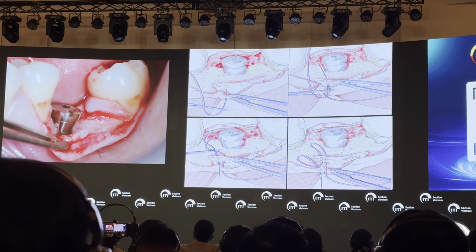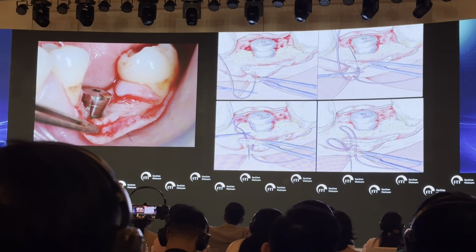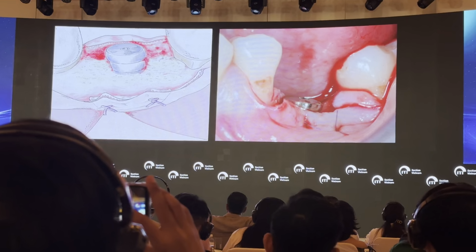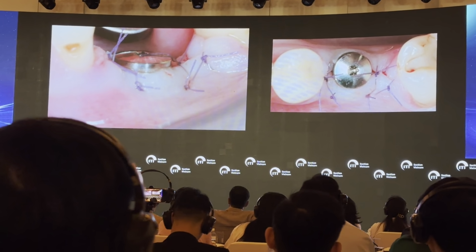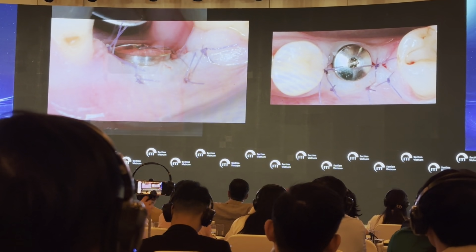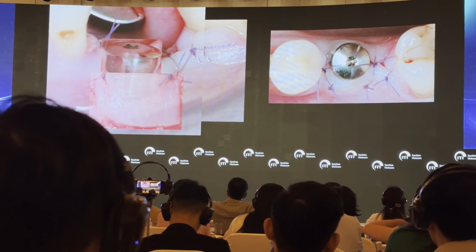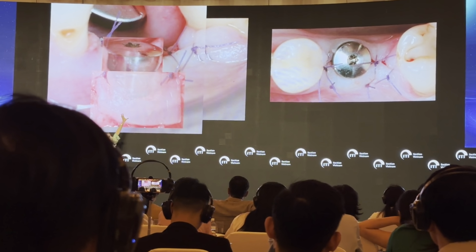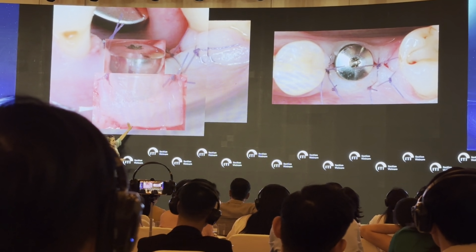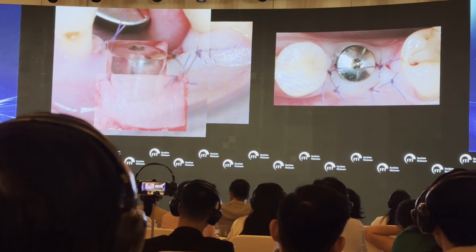The surgical papillae are free, the connective tissue graft is paramarginal, so at the time of suturing, I will put the surgical papillae in contact with the lingual flap, and the connective tissue graft is going to be at this level, covering the tissue level component of the implant and completely covering the buccal bone dehiscences, and the apical part of the graft is above the buccal bone. And the flap is coronally advanced.